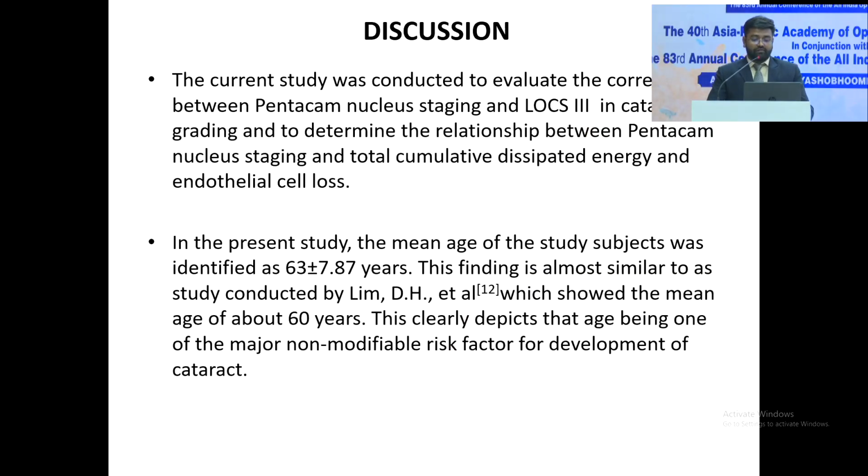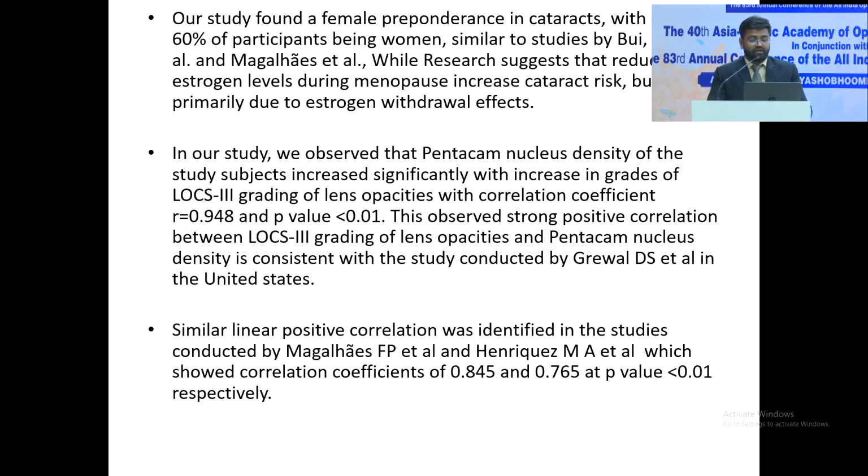So the current study was conducted to evaluate the correlation between Pentacam nuclear staging and LOCS III cataract grading, and to determine the relationship between the Pentacam nuclear staging and cumulative dissipated energy and endothelial cell loss. The present study included subjects of more than 60 years, which is an age-related, non-modifiable risk factor. In our study, we found that about 60% of the patients were female.